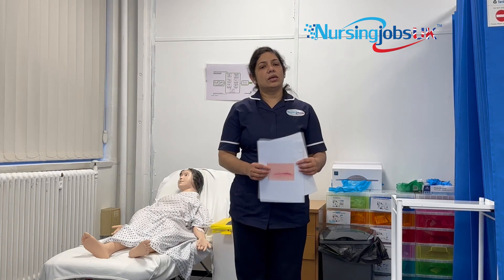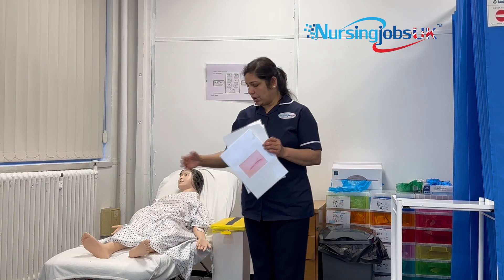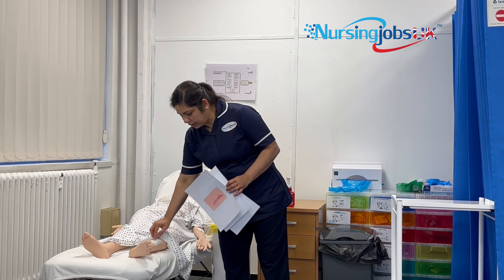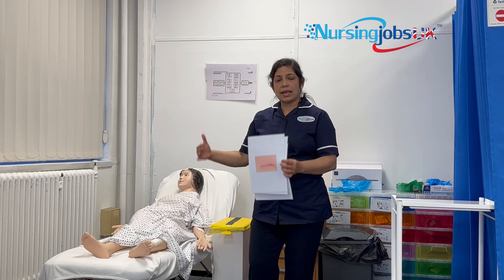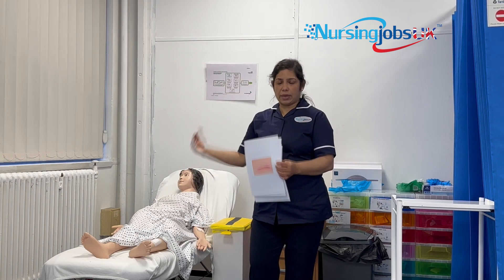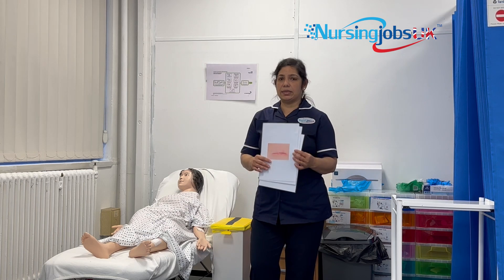In wound assessment you won't be getting a real patient — it's a mannequin. You will either get a picture of a wound or a wound model like this. You need to assess it as if it were a real wound, and you need to verbalize each finding. Once you assess the wound, you will go and arrange the equipment for ANTT.